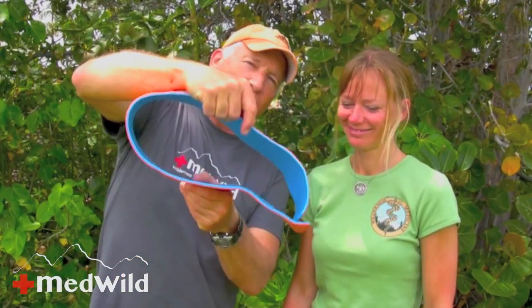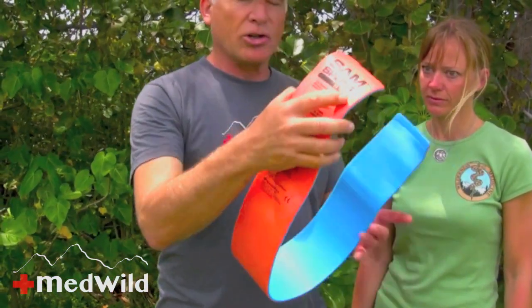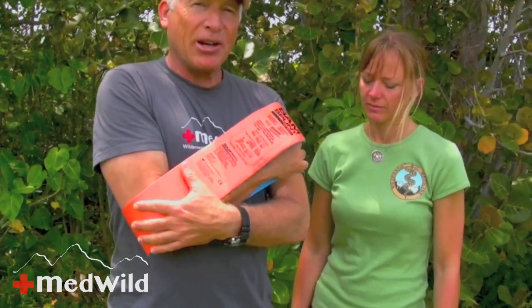That's why this is called a sugar tong. The reason we use a sugar tong is because there are two bones in the forearm. If we just stick a splint on the top and bottom of the forearm, we're not really limiting rotation. By using a sugar tong, which will go around Denise's elbow, we'll be able to control rotation of her forearm — which is really important after any fracture of the forearm, and in this case a distal radius.